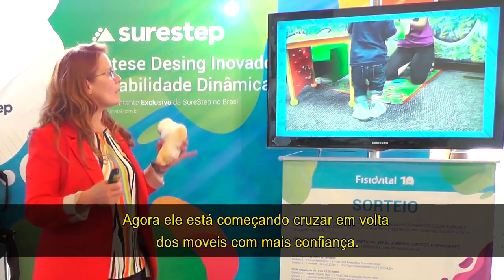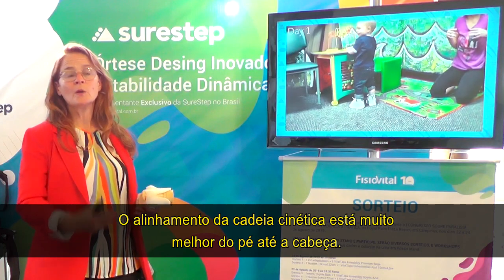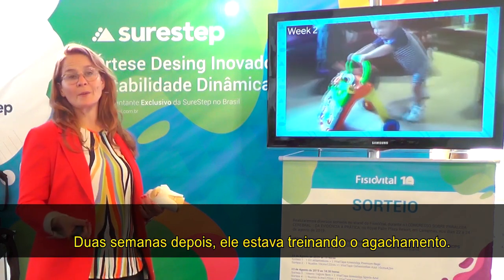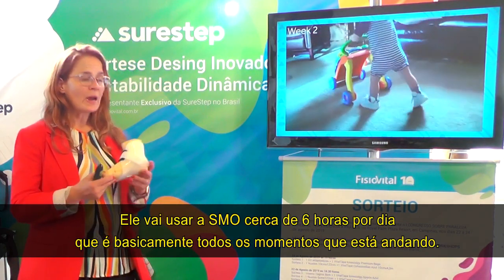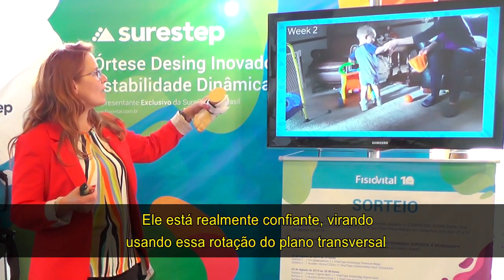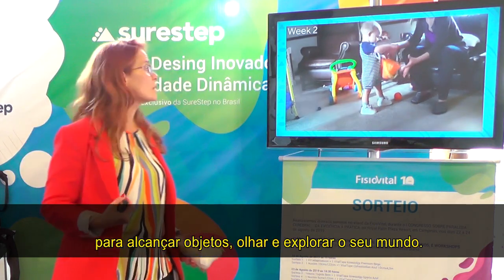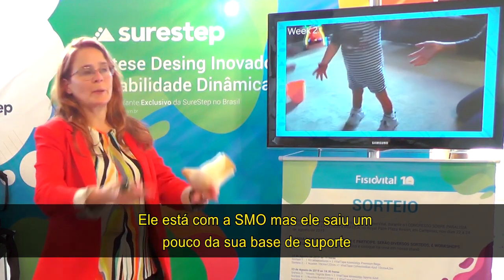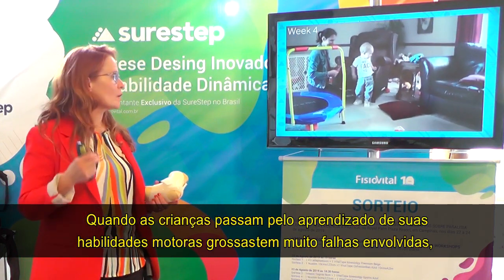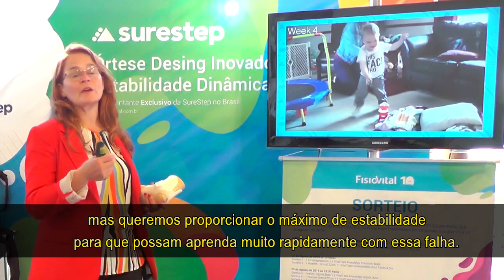Now he's beginning to cruise around the furniture with much more confidence. We see better alignment — that kinetic chain alignment is so much better from the foot all the way up. This is two weeks later. He's working on squatting and needs a lot of practice, so he'll wear these about six hours a day, which is basically all his walking moments. He's really confidently turning, using transverse plane rotation to reach, look, and explore his world. As kids go through learning their early gross motor skills, there's a lot of failure involved, but we want to give them stability so they can learn quickly from that failure.